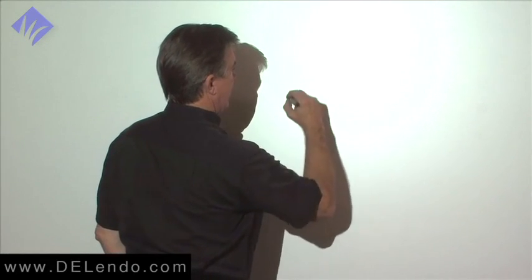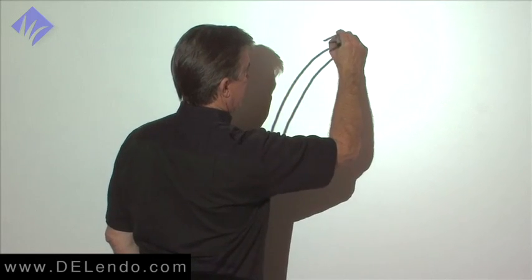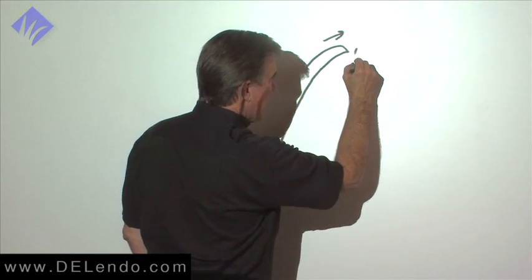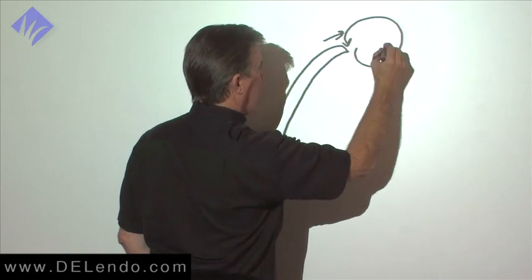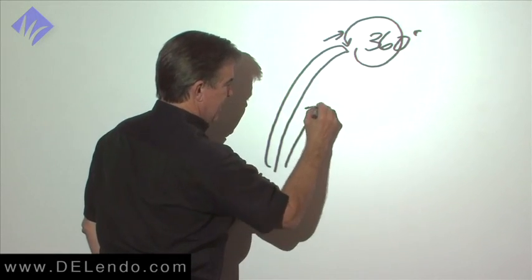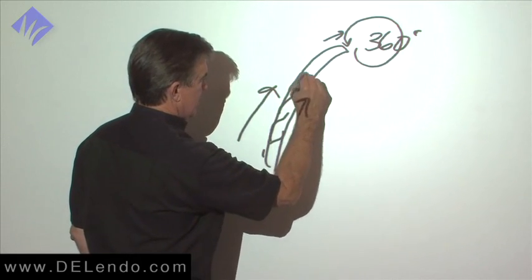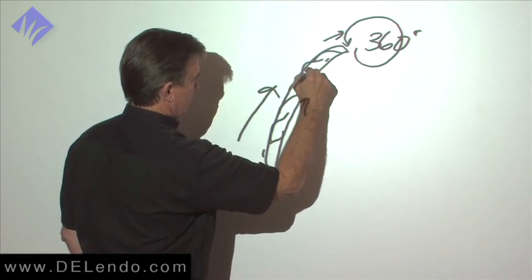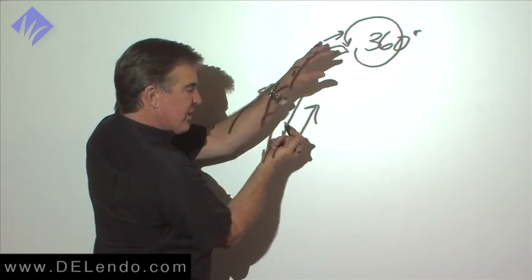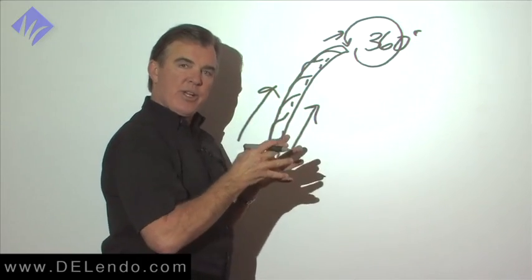The blade advances some small amount, and then while we're at that position, we're going to rotate the file counterclockwise 360 degrees with serious apical pressure on it. Okay, this is a blade, sorry. And by holding it in place and rotating this file counterclockwise, the blades will center in the root canal.